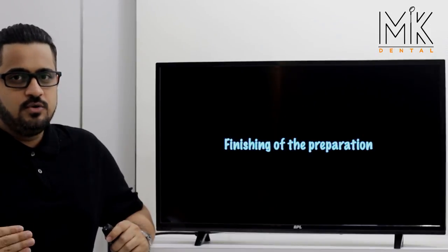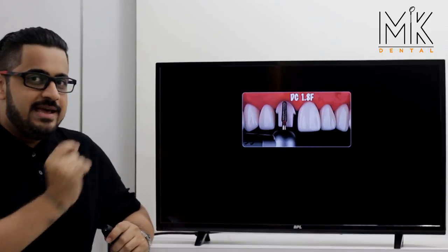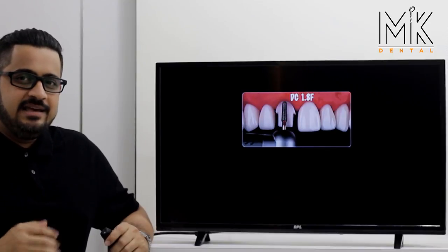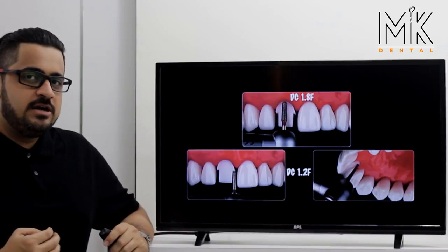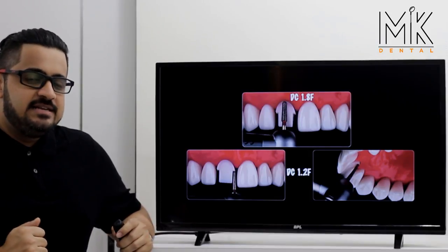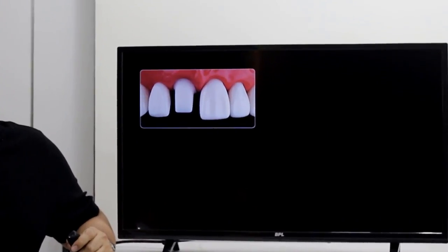Once through with all of this, your gross preparation is complete and you proceed with finishing. For finishing on the labial aspect, the kit has the DC 1.8F burr — a red ring burr — which achieves a uniform 0.8 to 0.9 millimeter reduction on the labial aesthetic area. Toward the proximal, lingual, or palatal margin, you can be more conservative with the DC 1.2F burr, as these areas don't need as much reduction. Let's conserve as much tooth structure as possible.